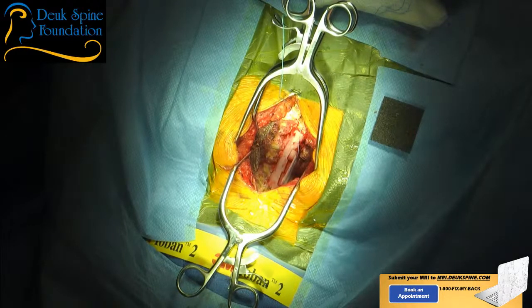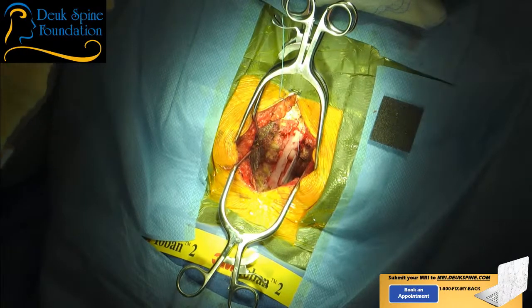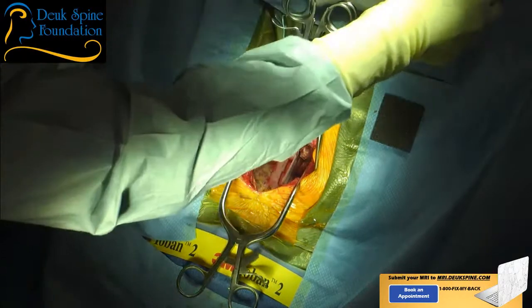of blood. You've probably seen it. Yeah. It becomes just a bloodbath. You need Moses to part the Red Sea. So you see what proper positioning does, what proper blood pressure control, what proper muscle relaxation does. It's a totally different surgery.